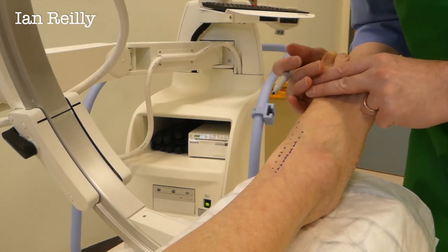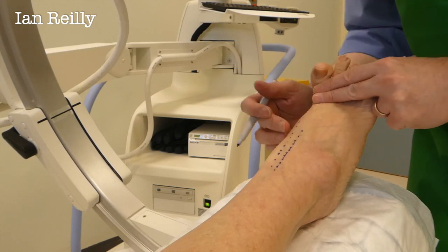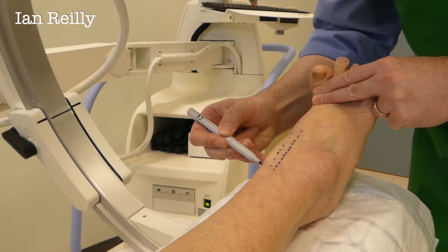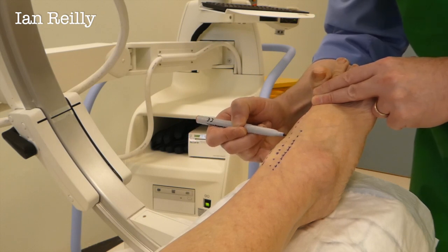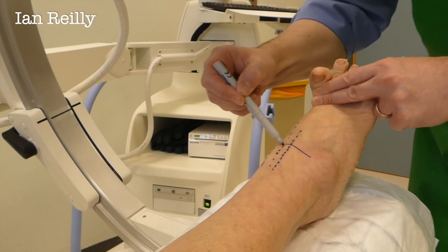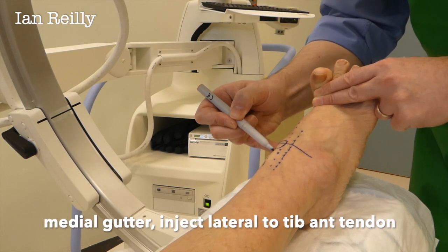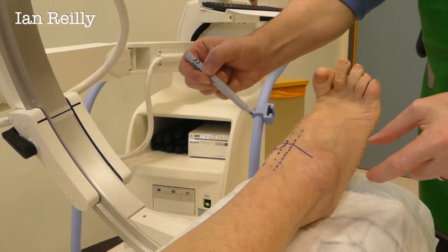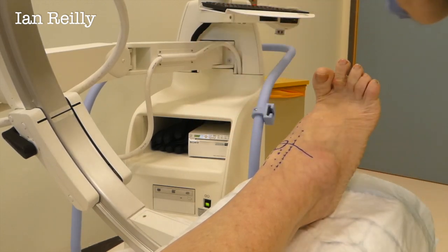If you pull your foot up for me — all the big tendon is coming there. There's your ankle level there, so I really want to be in that level there. That's coming in between — there's your ankle joint going from left to right. Tendon, tendon, nerve. I mark up the bits to avoid so I don't want to stick a needle through the good stuff. I want to get a needle to that bit.